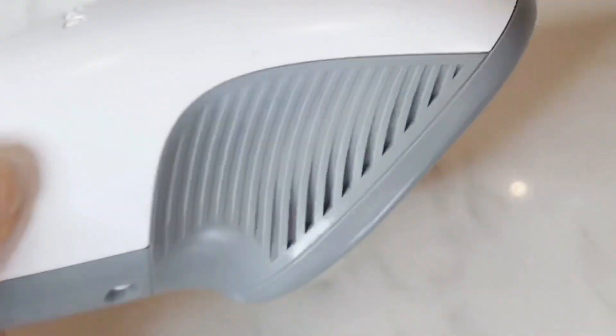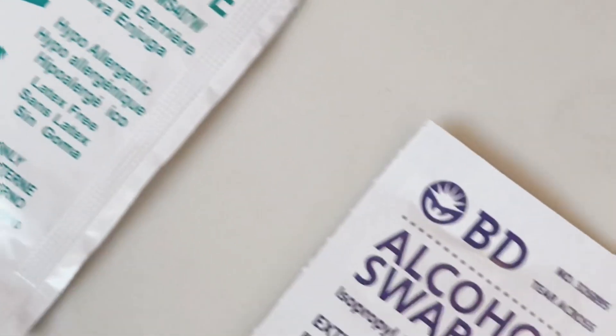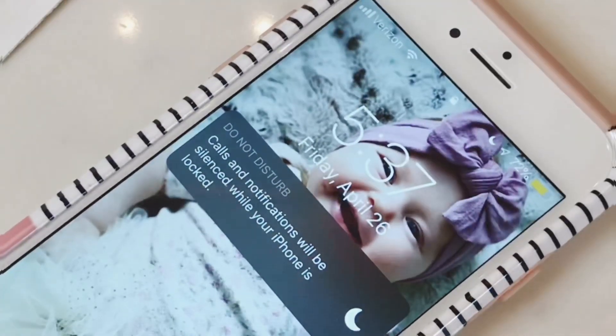Today we're going to use our G6 sensor applicator, of course. We're going to use overpatches, then we're going to use Skintac, an alcohol swab, and then lastly we're going to use a Dexcom receiver, phone, or tandem pump.